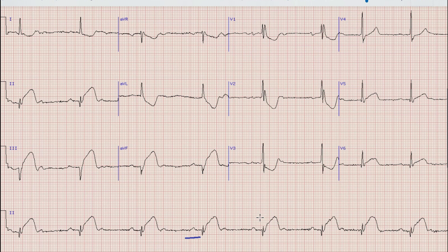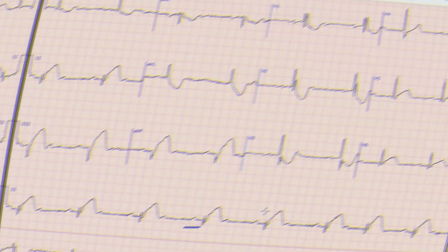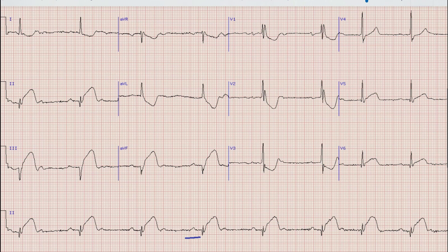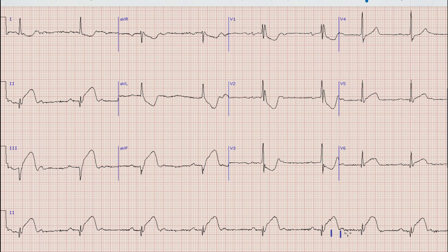After rhythm, the next thing we look at is heart rate. For heart rate, we find a QRS complex which lies on a broad vertical line, then count the large boxes between that broad vertical line and the next QRS complex as 300, 150, 100, 75, and 60. So the heart rate in this case is between 75 and 60, which is most likely 65 beats per minute.